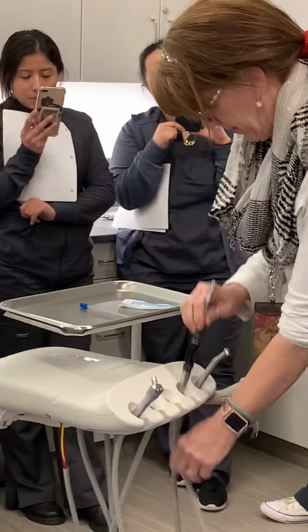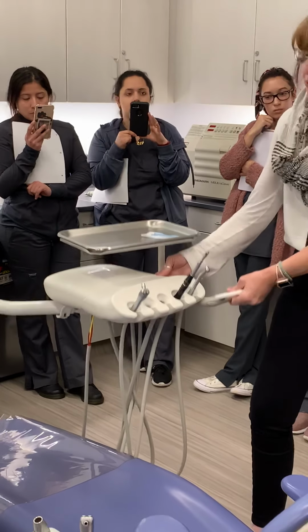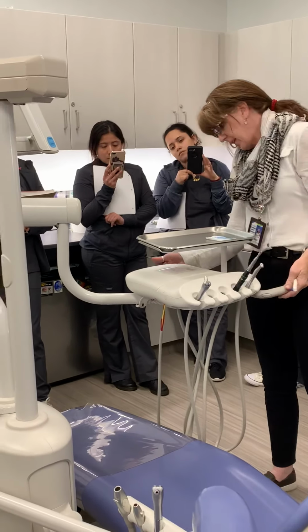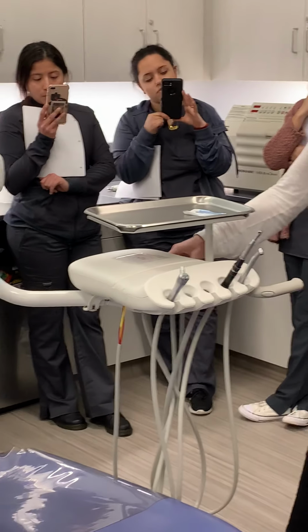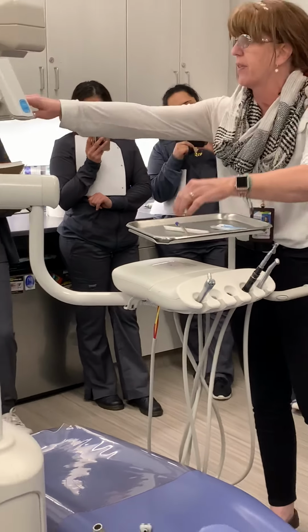Then we have the power or the toggle switch here is for the master switch to turn the unit on and off. If we have the compressor and pump on, the arm will stay up, okay? This is to release built up pressure, we never mess with this. And these buttons are for the doctor to adjust the flow of the water or air to the handpieces. So we don't adjust those either.